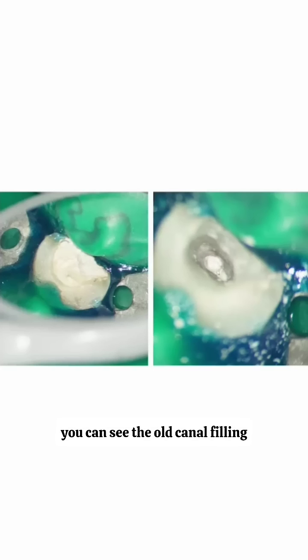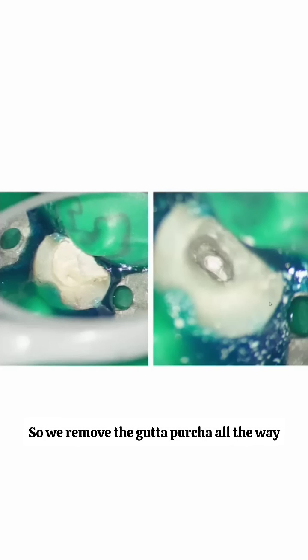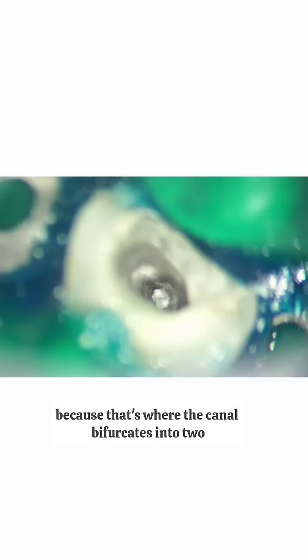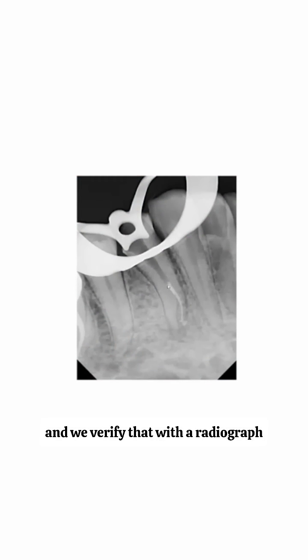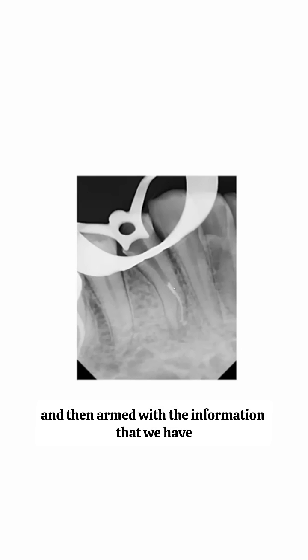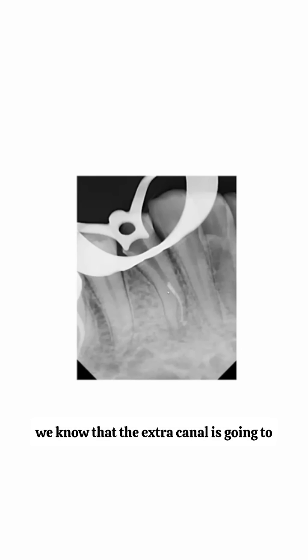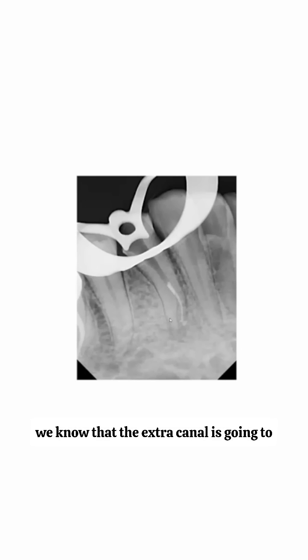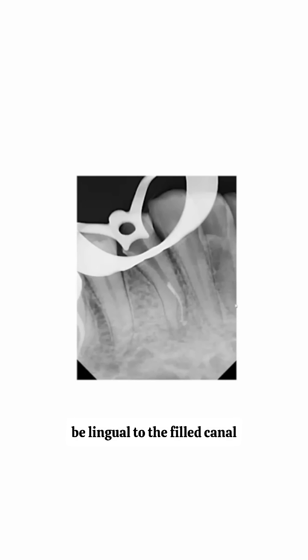Once the temporary filling is removed, you can see the old canal filling. We remove the gutta-percha all the way down to the bifurcation level, because that's where the canal bifurcates into two, and we verify that with a radiograph.